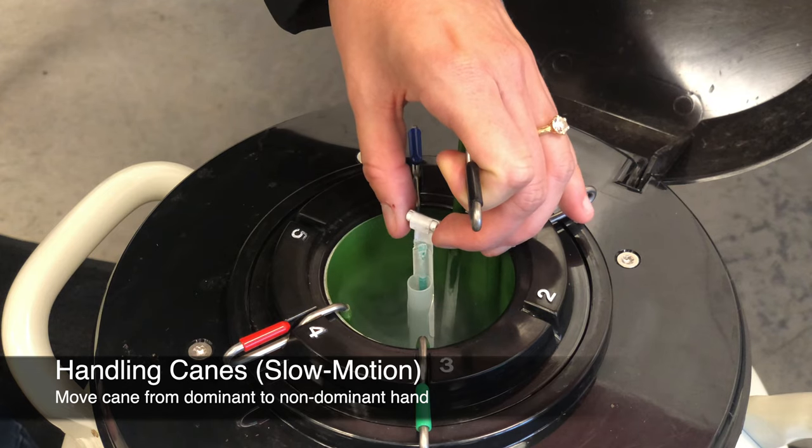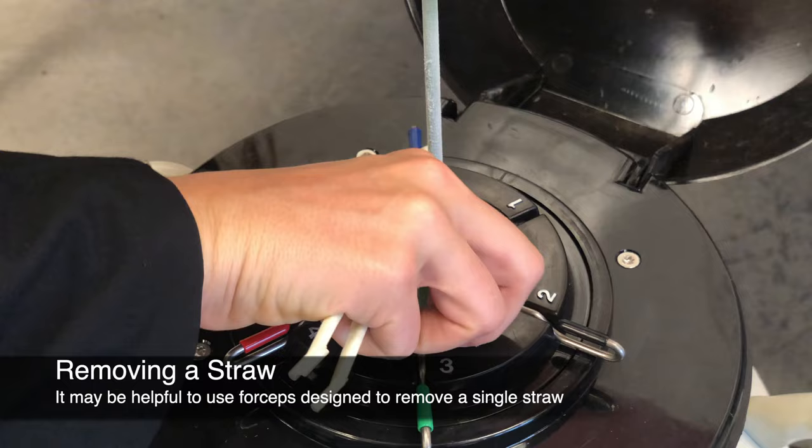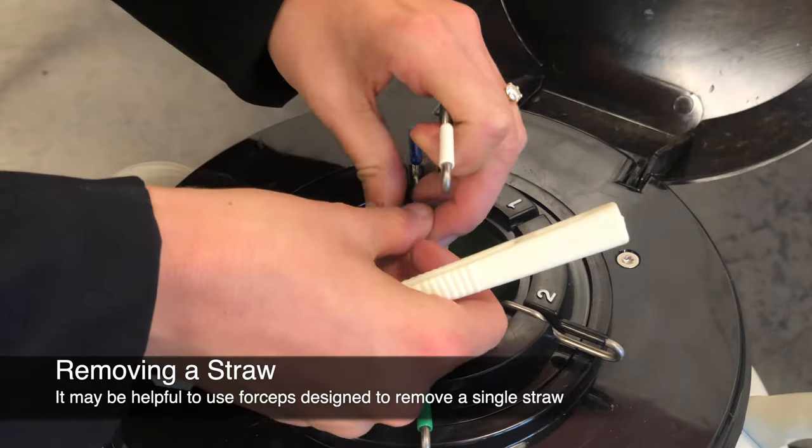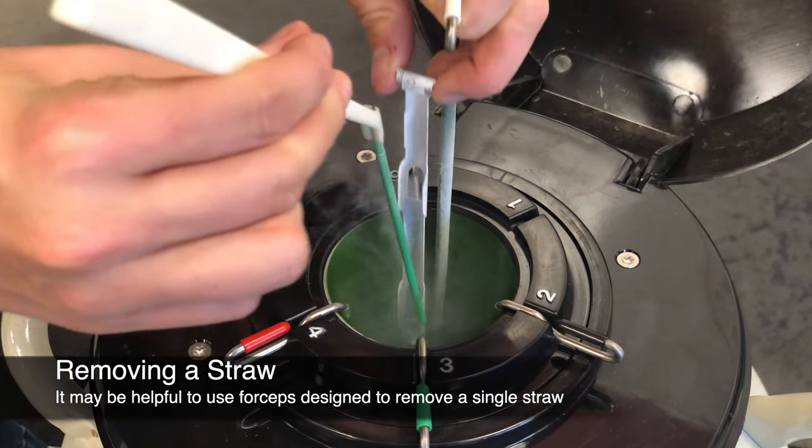It will take some practice to become comfortable with this movement. Remember that your fingertips are a heat source, so only touch the straw or straws you will remove from the cane for thawing. It may be helpful to use forceps if removing only one straw for thawing.